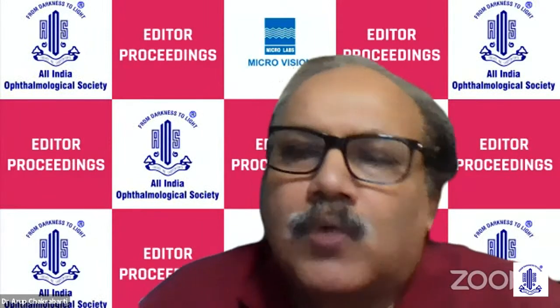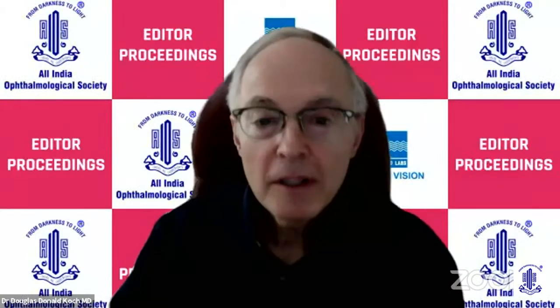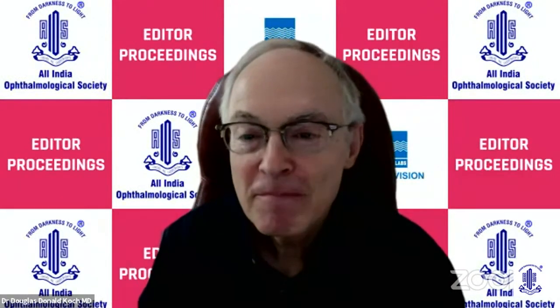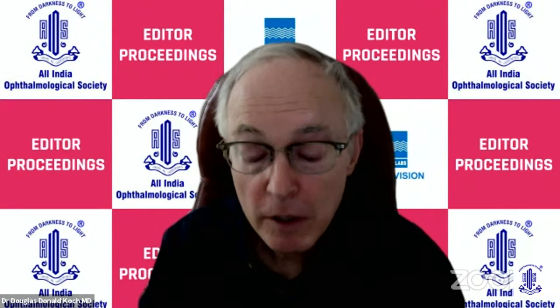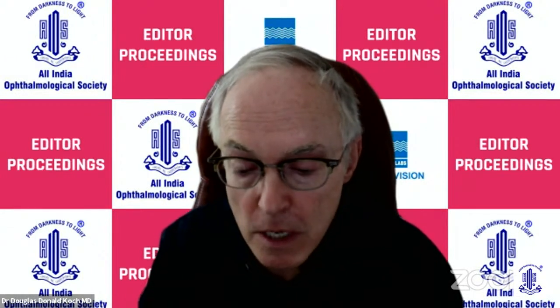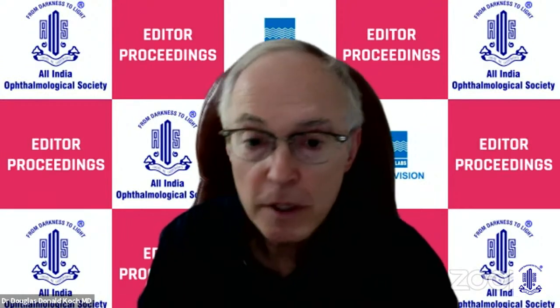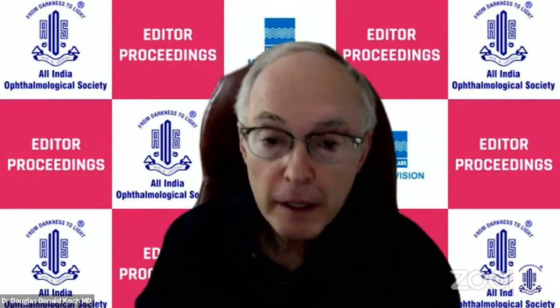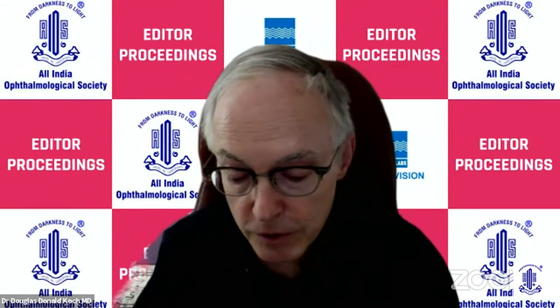Yes. So Doug, what is your take on this? I mean, how do you go about this issue? Well, I'm going to be a little contrarian about this, which is to say, I think we all need to look at our outcomes of our IOLs and how accurate we are. But there are a lot of things that go into our constant optimization. One of them is the lane length, and are we refracting at 3 meters, 4 meters? Are we adjusting for 6 meters?